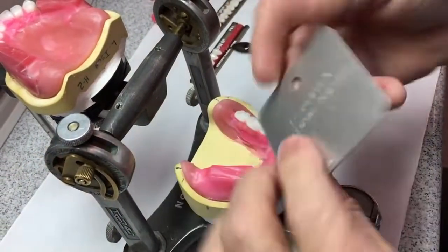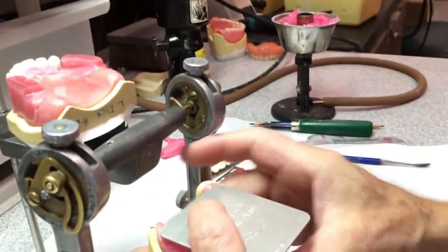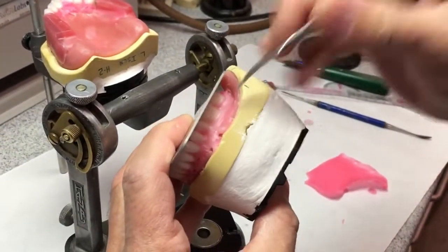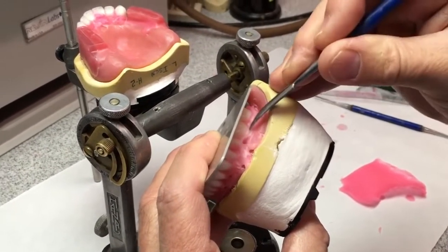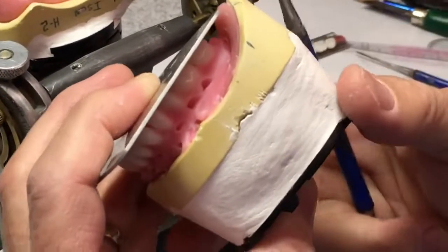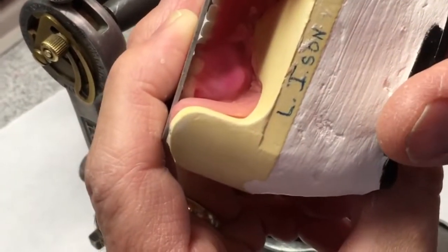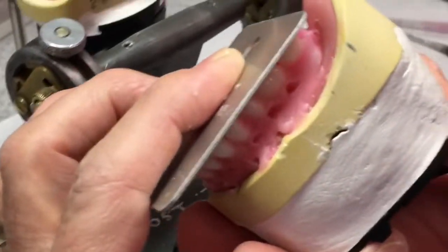So I want these teeth now to be exactly on the plane. I'm going to put the plane on there. I'm pretty close, but not perfectly on it. The trick is to take a cold instrument — not to heat the wax back up with a hot instrument — and push the teeth up on the plane. We want buccal and lingual cusps on the plane. The wax isn't fully cool so I'll have to recheck it, but that's pretty close to what we're after.